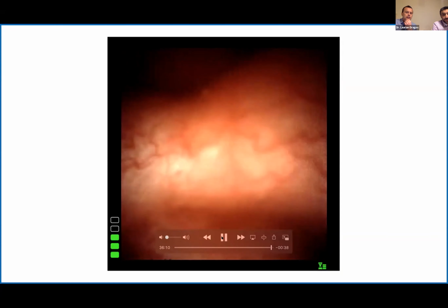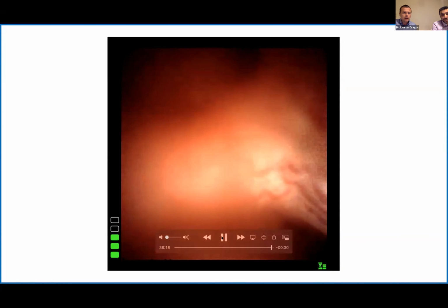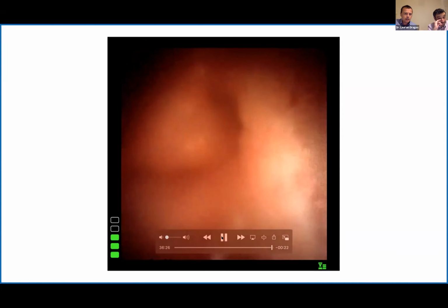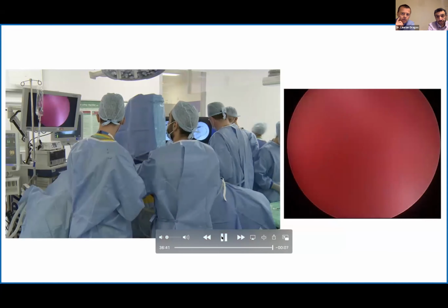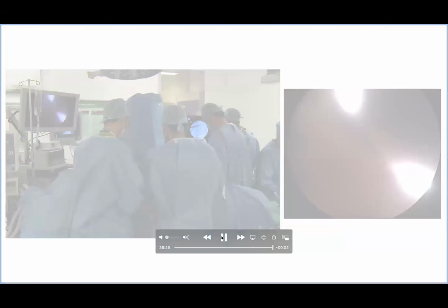We've decided that, as for exit strategy, nephrostomy is not required. We can just put a stent in, and I went back into the calyx, the upper pole calyx where we removed the stones from, and the guide wire gets in, and that's the end of the video. So then you've got the guide wire, and then we did a retrograde stent, and Laurian's inspecting the ureter as he's leaving. You can see on the right the image of the nephroscope going out. So you've done a fantastic job there.